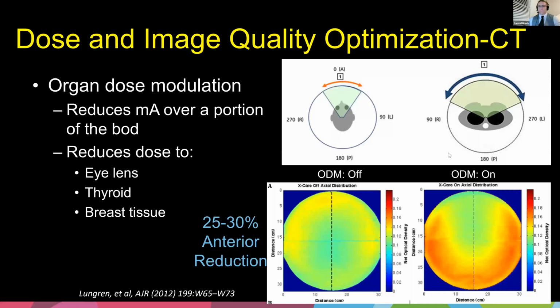I see. And my second question is about the dose alert level. You said that we should set a level to alert. Is this a real-time alert, or is it a retrospective alert?